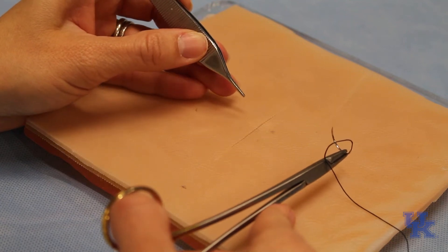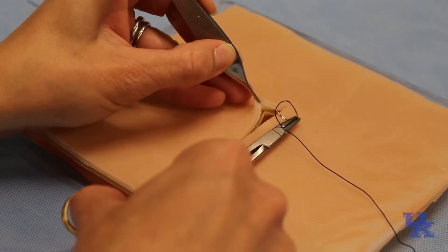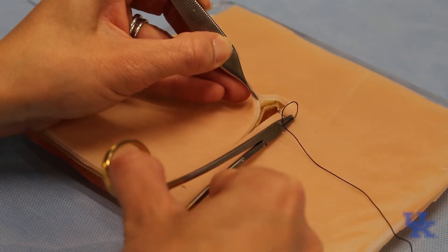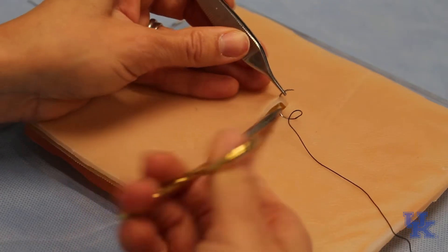I'm going to demonstrate a running subcuticular stitch. There's different ways to throw the knots, but I like to start with a buried knot close to the skin edge, which is where you start deep. You come out right below the epidermis.